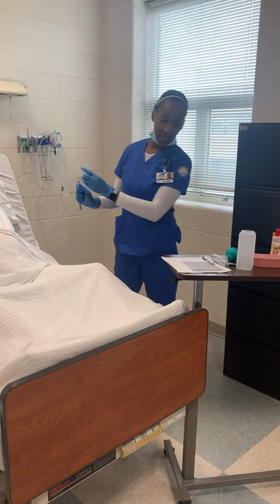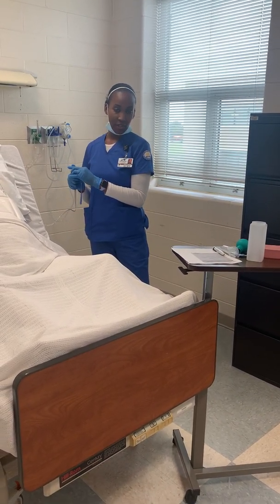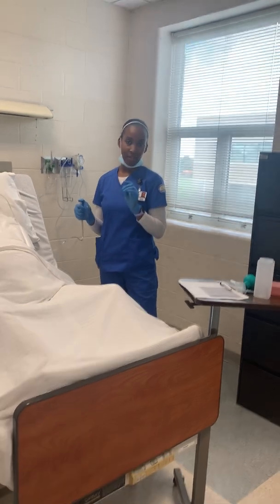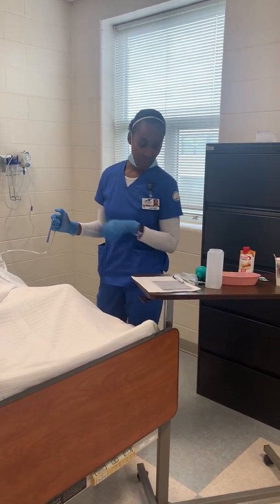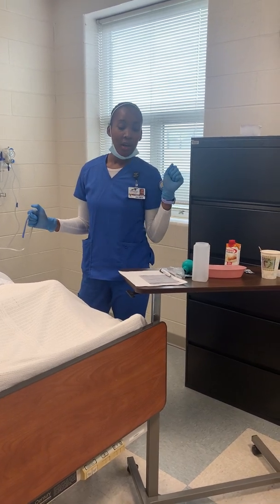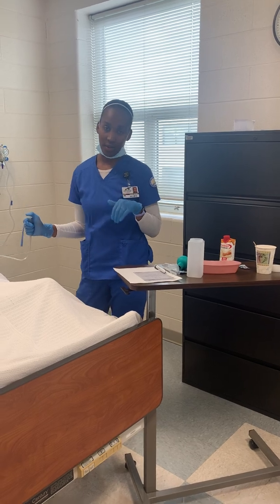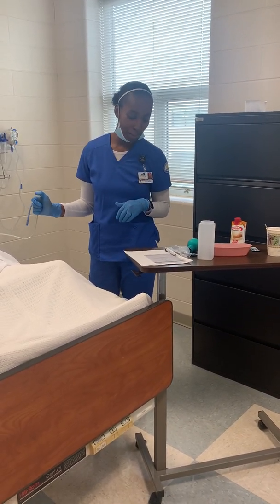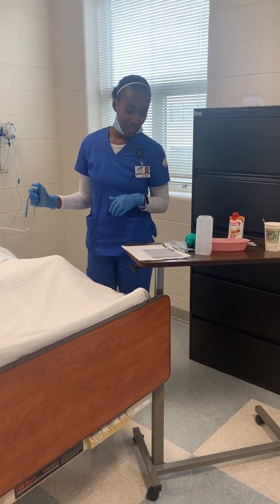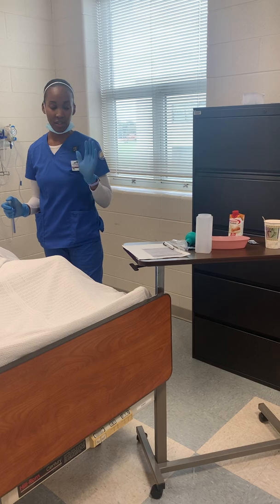before I give her the feeding, I would have checked the residual. So I would aspirate the contents, make sure it's less than 150, and then give her the feeding, which it's less than 150, so I gave her the feeding. And then once I'm done with the feeding, then I can go ahead and document.